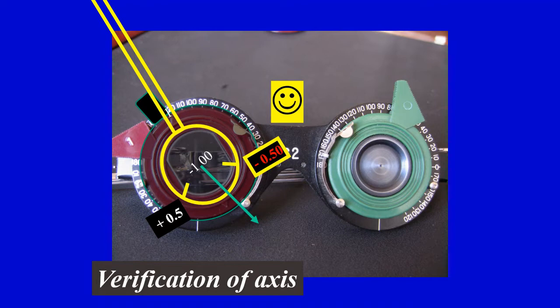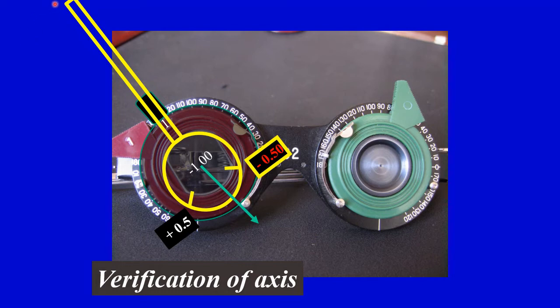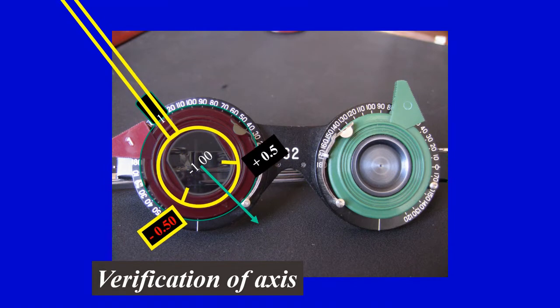toward the direction of this -1. Then we are going to repeat. Now we change the position of the handle of the cross cylinder to be exactly in the new position of the test cylinder. Then we do flipping again. Suppose the patient told us it is better this way. So again, we are going to rotate the cylinder tested in this direction.